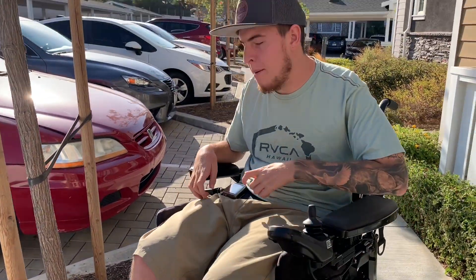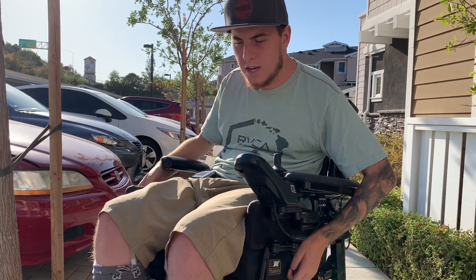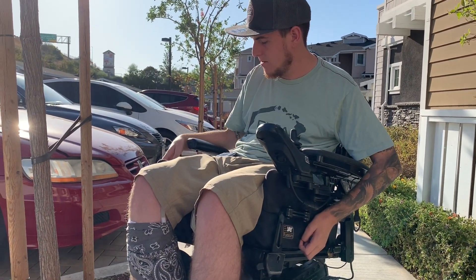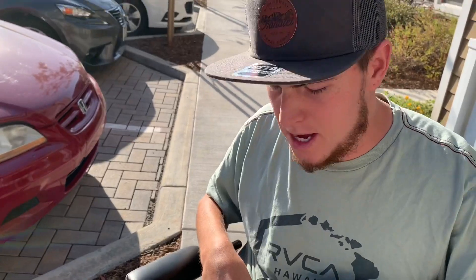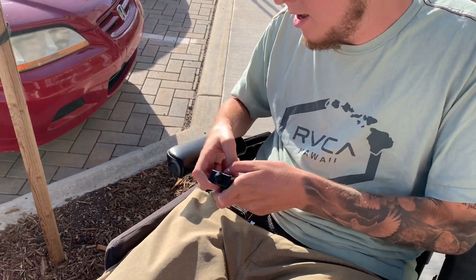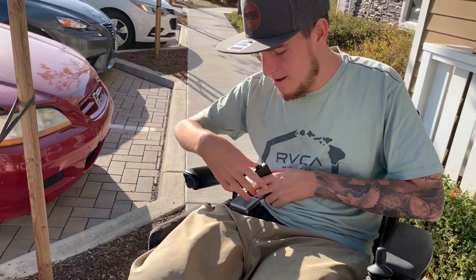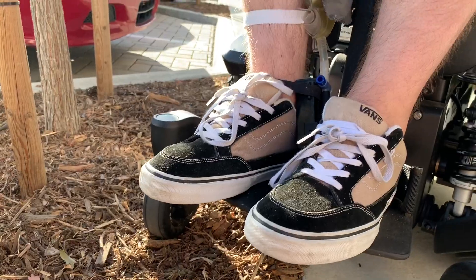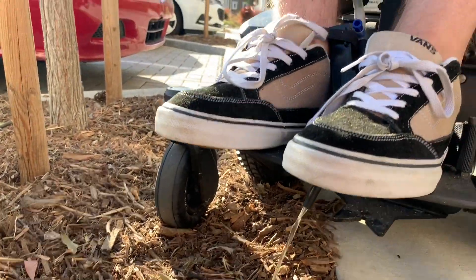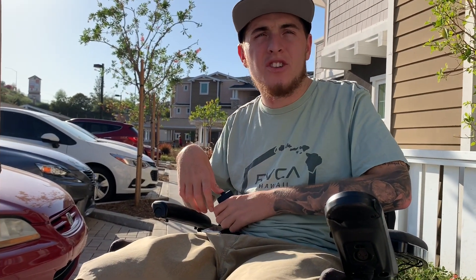Usually when I'm at my apartment, I'll roll into this dirt area right here to drain my bag. I'm going to recline back a little bit so you can see it draining. Here's the button that I push — I have it attached to my shorts. I'm going to push the button right now and it's going to drain. All from just pushing this button. I let go of it and it stopped, then I'll push it again and continue draining. So yeah, this is the Freedom Flow.